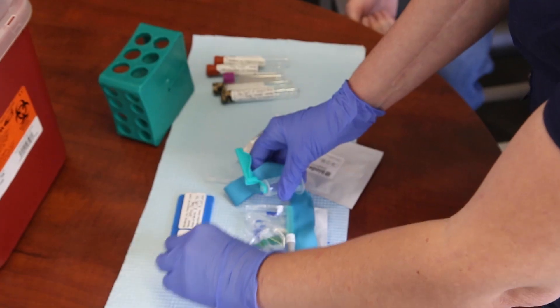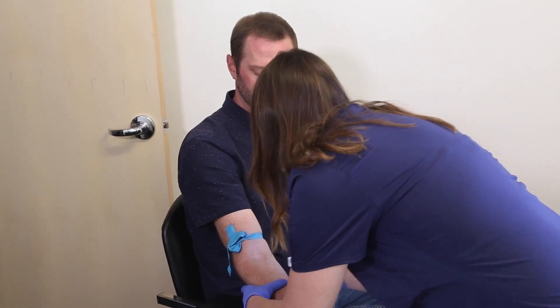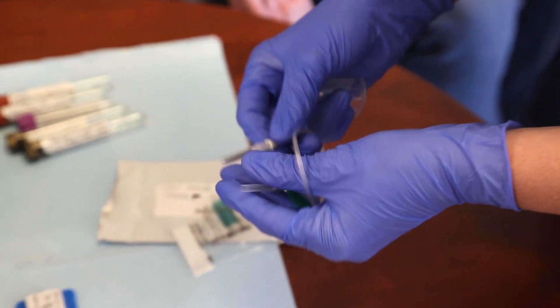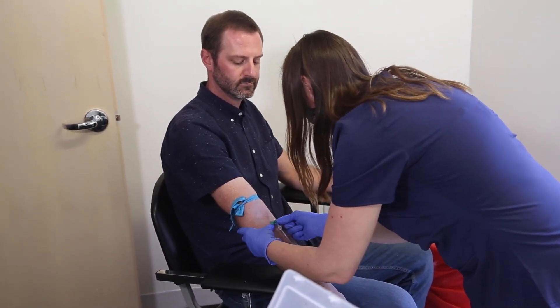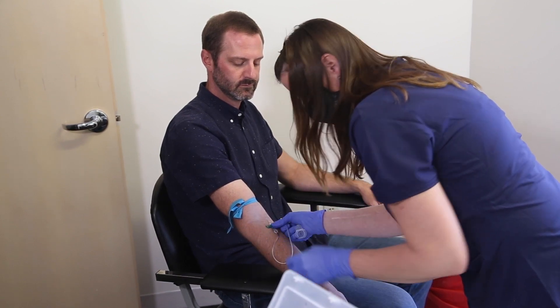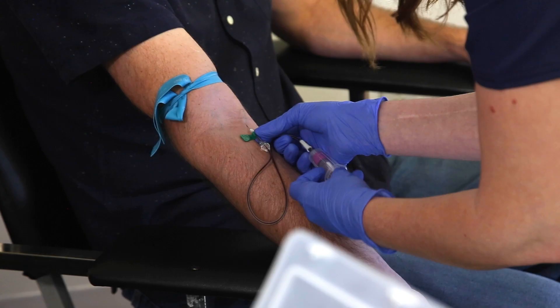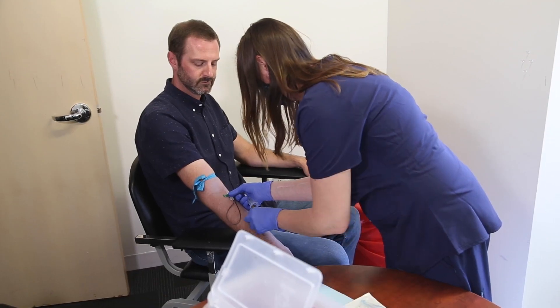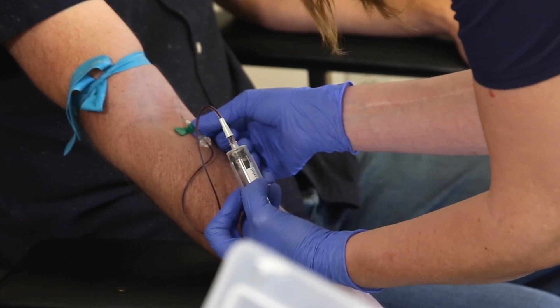Next, open the needle package and prepare the patient for venipuncture. Draw blood from the patient, filling each blood collection tube. For the patient's comfort, do not remove the needle between blood tubes, and make sure the blood collection tubes are at least 80% full.